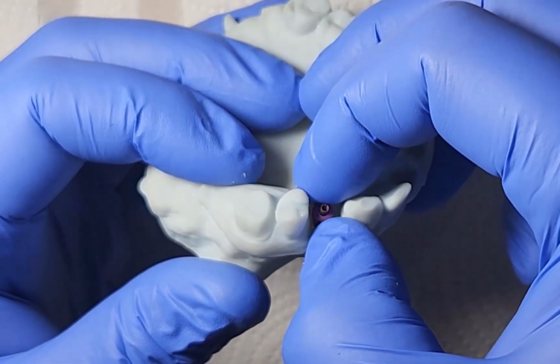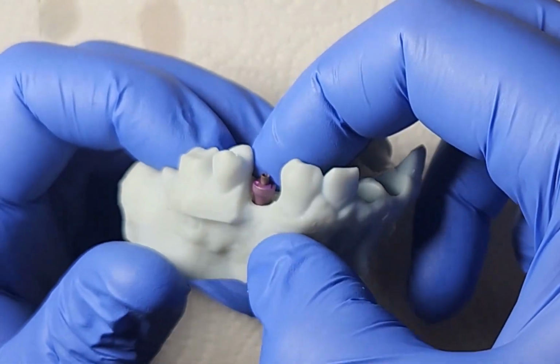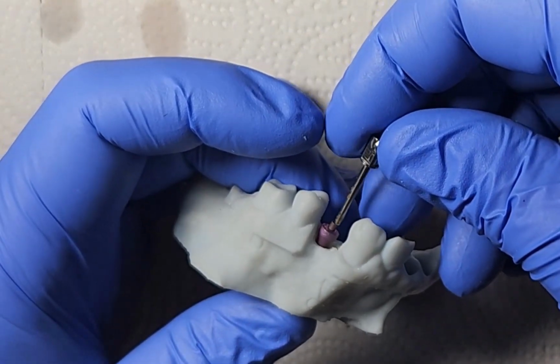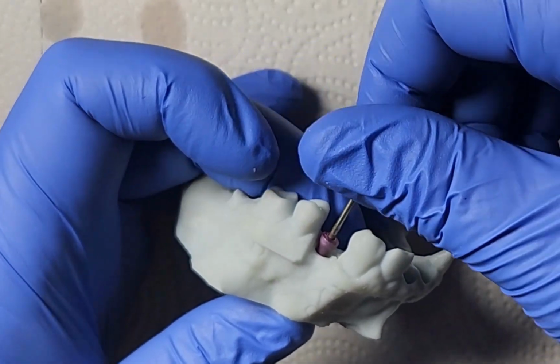And so these are indexed, meaning that they've got the little hex on them that the implant would have, just like a standard abutment. And so you want to make sure that that seats in there fully, and then we're going to go ahead and drive this in, and we'll just go 2-finger tight.